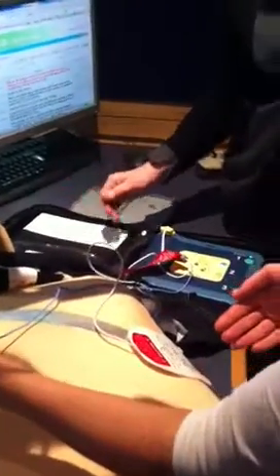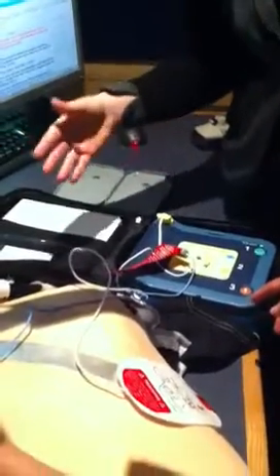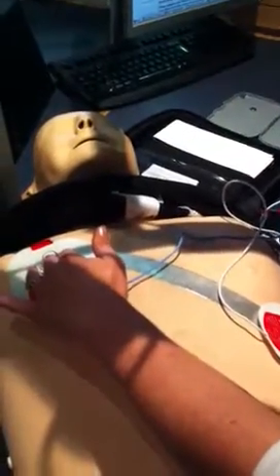And the reason you don't want to touch, if you got a little shock, it wouldn't hurt you. But what you're doing is stealing some of the shock that should have been going to that heart. This is remarkably easy. It is, and that's why we're kind of... You know, the more people that know this, the better. Yeah, so 30 compressions, 2 breaths in introducing the defibrillator.